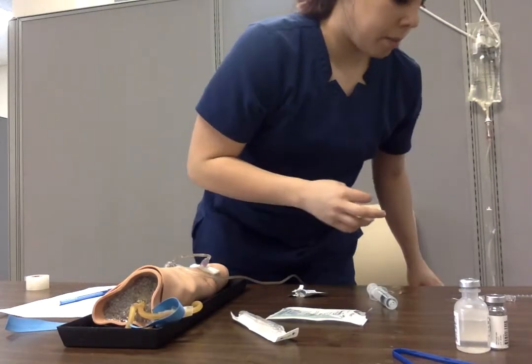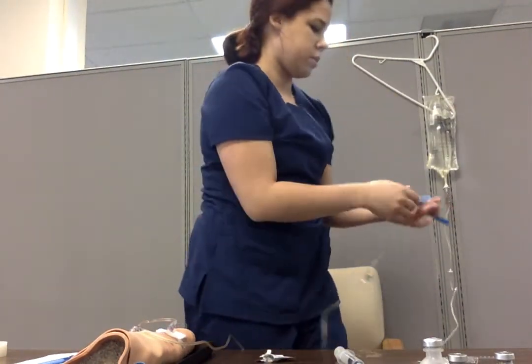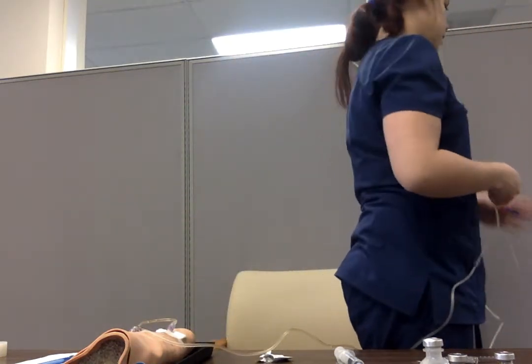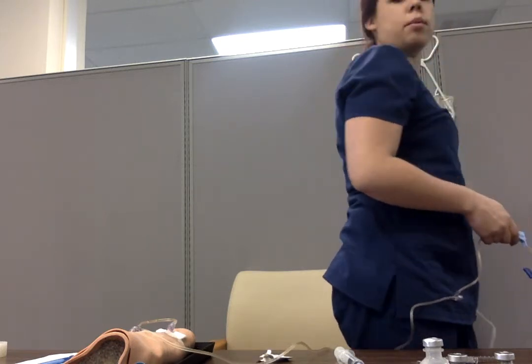And then I'm going to set my drip factor to 15 or 7 drips for 15 seconds. Because then that would even out to 28 per minute.